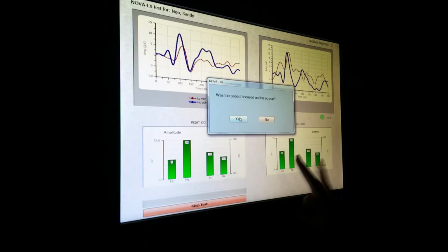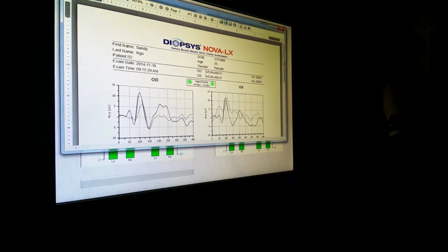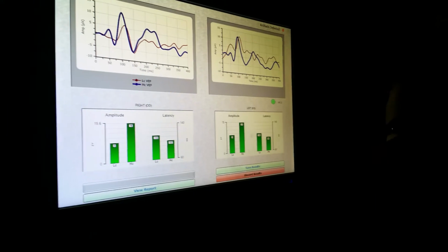So again, you see we have our nice screen readings here. So we're going to say yes. So what do you guys think the purpose is of me letting her know that she's halfway there? She doesn't get impatient. You got it.